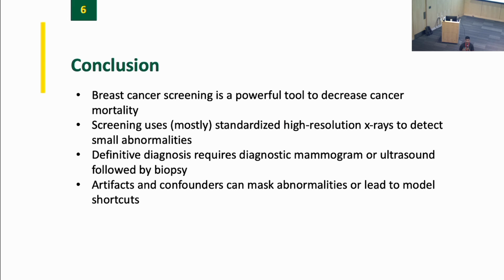Yeah, we'll talk about that when we talk about the structure of the data set. For example, a given screening exam has 4 images, and there's a patient identifier, but there's also an exam identifier. So you know that within this exam, this patient came on January 1st. Here's their right CC view, right MLO, left CC, left MLO for that exam. Then you can go to the next year and see their next exam. Was that your question about how to identify the views?